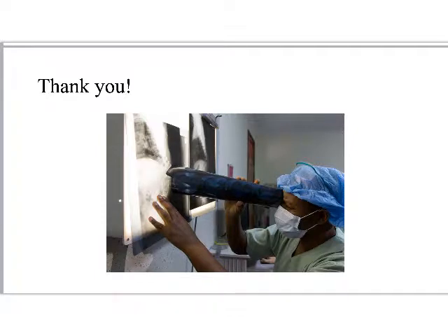All right, and I do want to point out that a lot of these things were more of a struggle back in the day, as they say, right? When we had light boxes and we were doing film imaging. A lot of it can be corrected for by digital systems, but this is an example. This used to happen even when I worked recently in the OR. Sometimes certain surgeons wanted to have images up on the light box in the OR, right?